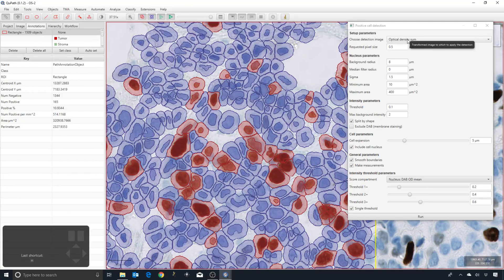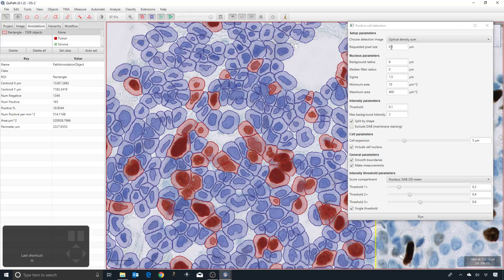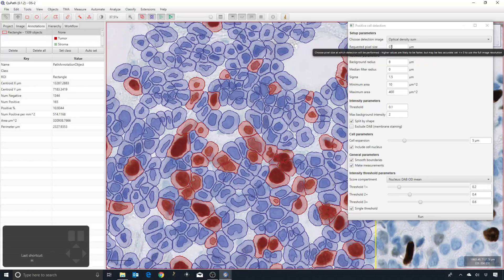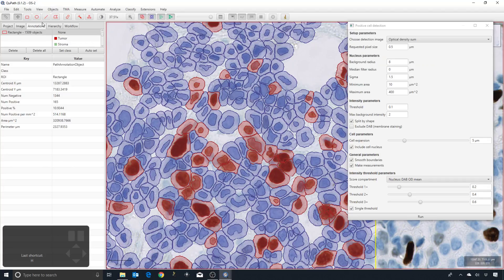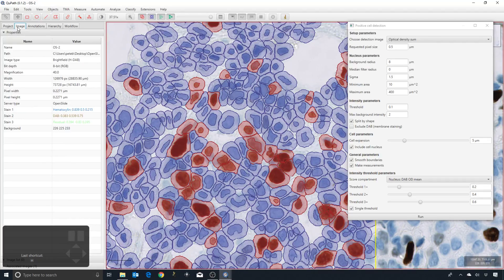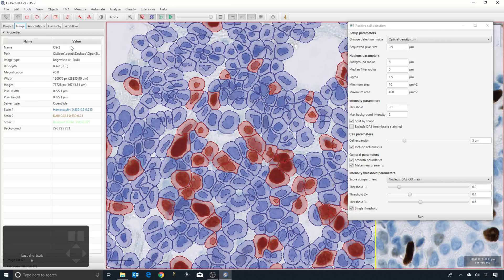The next parameter that we've got is requested pixel size, and this really defines the resolution of the image that QuPath will run its detection at. You can see it's specified to be 0.5 at the minute. QuPath doesn't necessarily use exactly that value because it tries to not resize by some strange arbitrary amount.